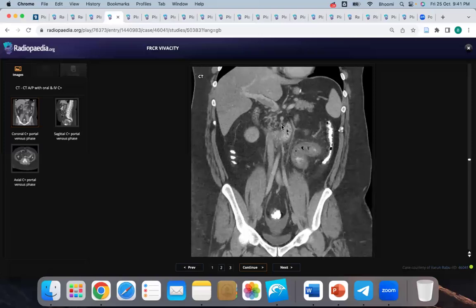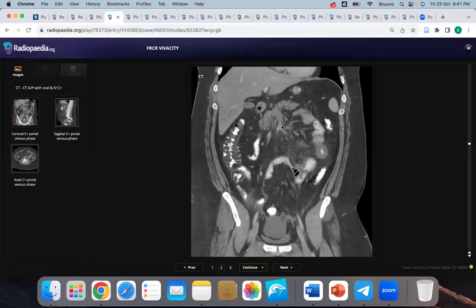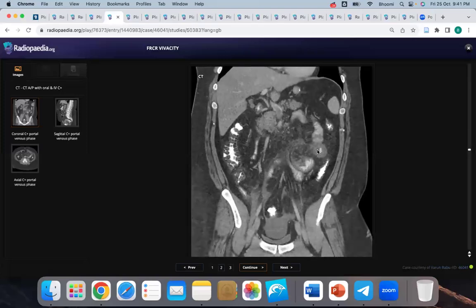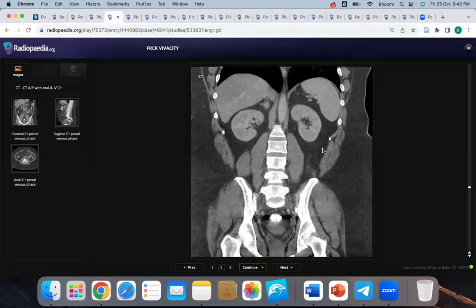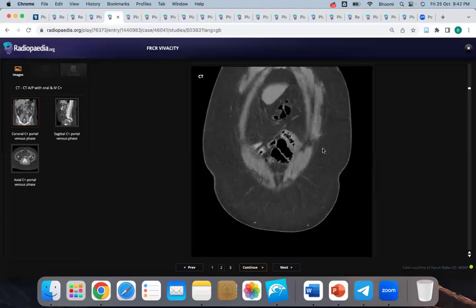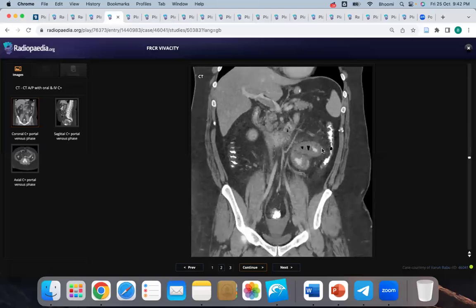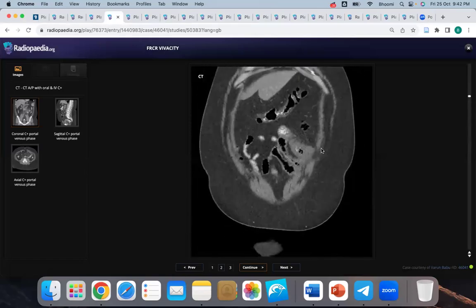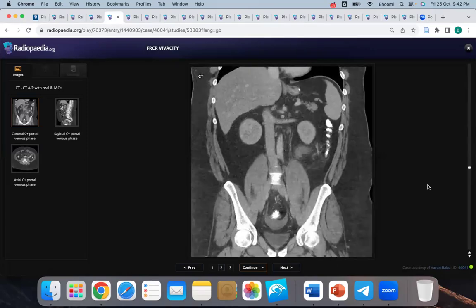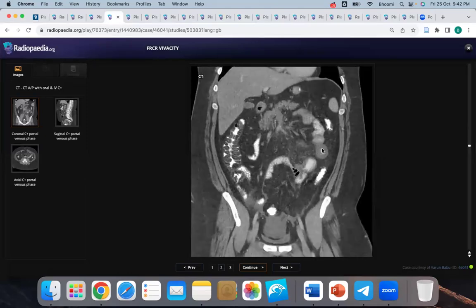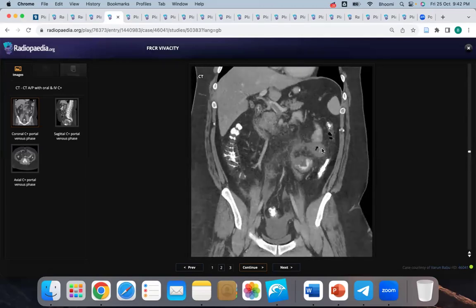This is a post-contrast CT abdomen — coronal cuts. There is portal vein thrombosis extending to the superior mesenteric vein, causing mural thickening of small bowel loops, mesenteric congestion, and smudging of perivisceral fat planes. This is an emergency — a case of venous ischemia of the small bowel. I will urgently inform the surgical team to commence anticoagulation. If not improving, the vascular interventional team can perform thrombectomy of the portal and superior mesenteric veins.